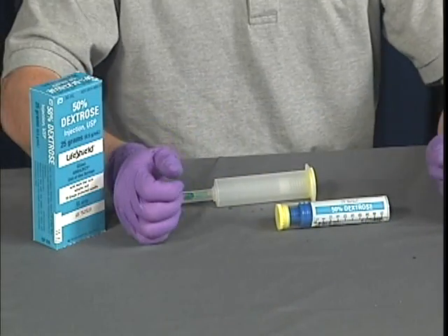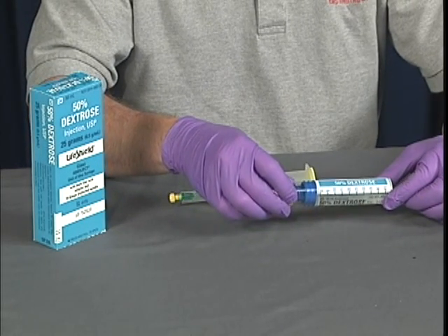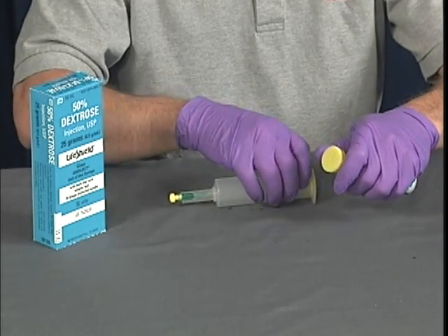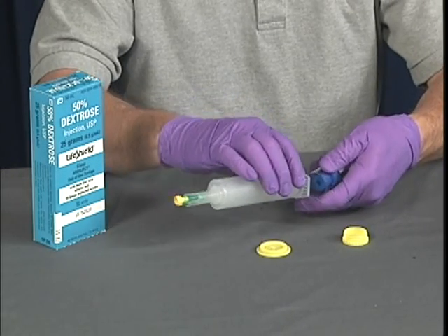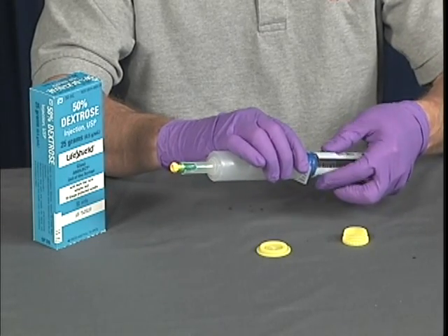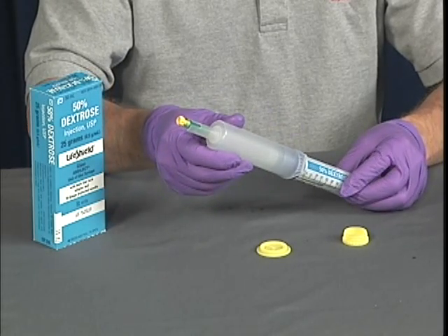When using preloaded syringes, always inspect the medication to verify the right medication, the right dose, the right expiration date, the right route, and the right patient. Remove the protective caps from the medication cartridge and the barrel of the syringe assembly. Insert the medication cartridge in the barrel assembly and rotate clockwise until the medication cartridge is secure in the barrel. The medication cartridge is now the plunger.